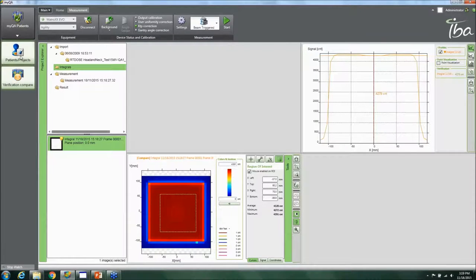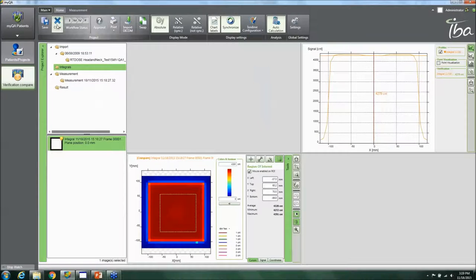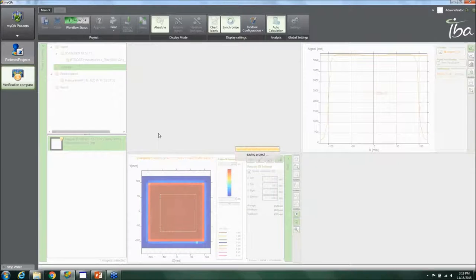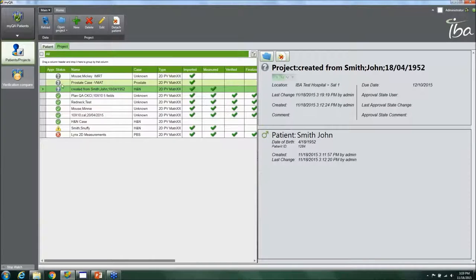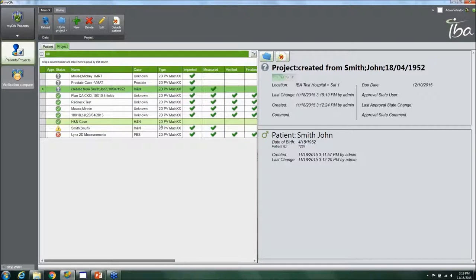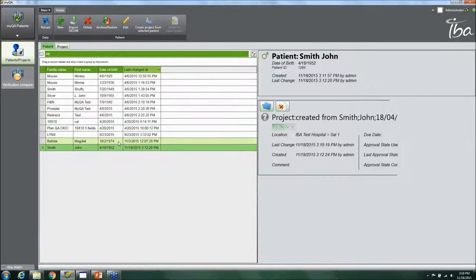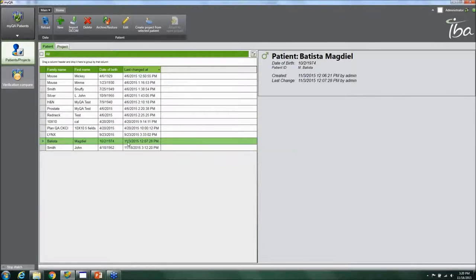Looking at real measured data, you can mark the workflow status as done — imported and measured. Clicking Save stores the plan. Back in the patient list, you can see which plans have been imported and measured, which have been verified, which need review, which failed, and which are still in process. Once treatment is complete, you can archive the patient inside the database so it doesn't take up active space.